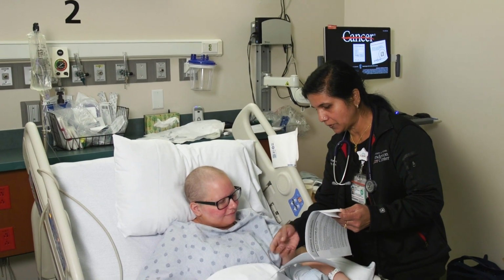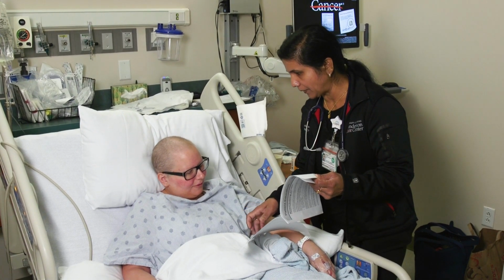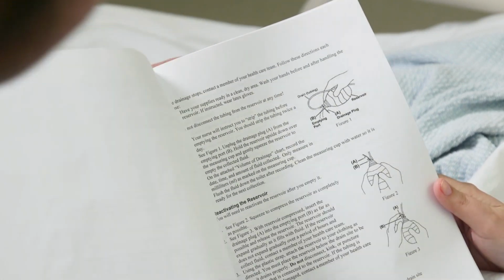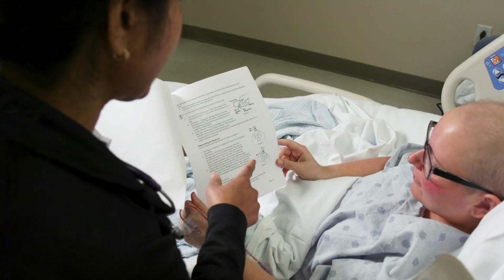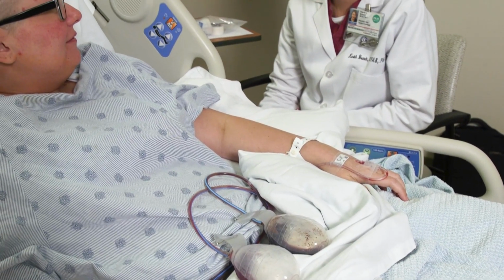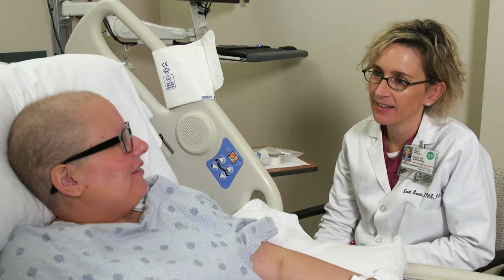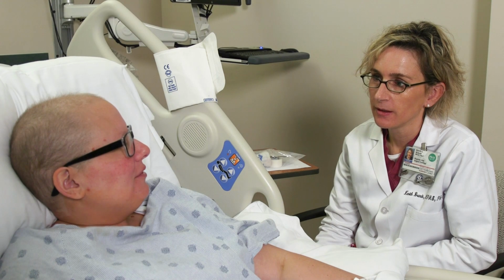Before you leave the hospital, you will be given all of the supplies and information to properly care for your incision, drain, and drain insertion site. It is very important that you carefully follow these instructions. You may find it helpful to write down your questions and concerns. Do not hesitate to call the breast center to speak with a nurse for help if you experience any of the problems mentioned in this video. If you are ever in doubt, please call the breast center. We are happy to help you.